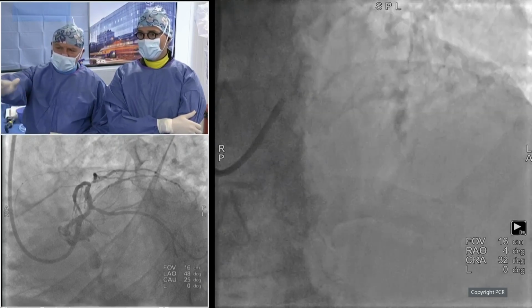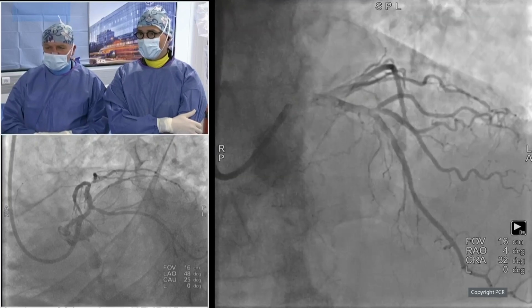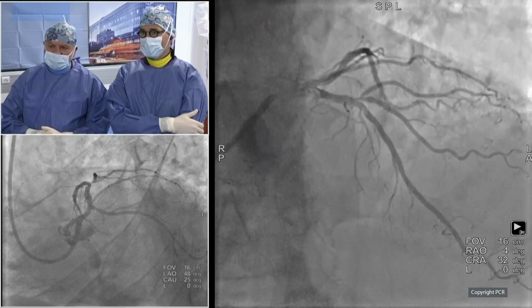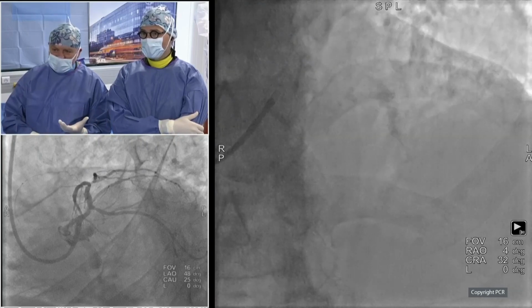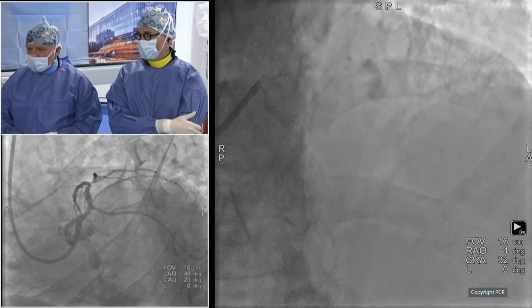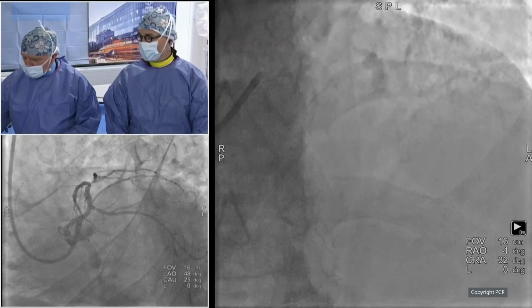We see some mild atheroma at the level of the mid-LAD with this ostial lesion of the diagonal. What we changed compared to the MSCT data is that we increased the diameter of the Shockwave balloon a little bit. Initially it was 3.5, but due to the angio, we moved to the 4.0. If you agree, we will now move to the plaque preparation with the 4.0 Shockwave balloon.